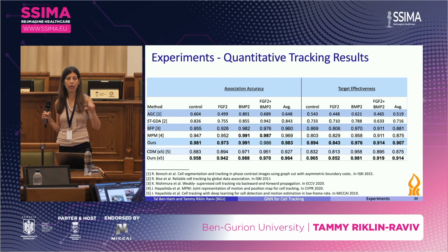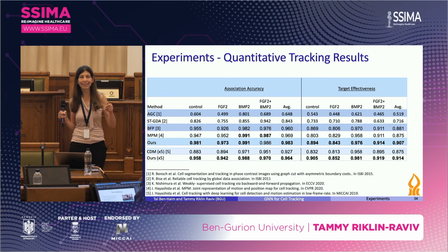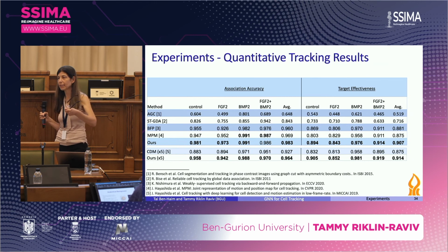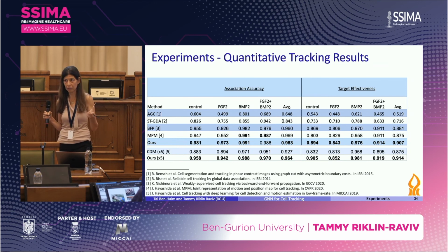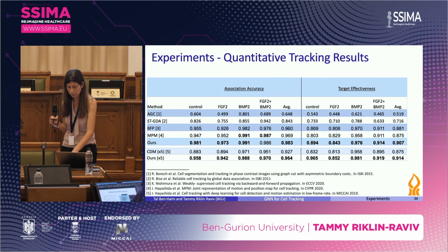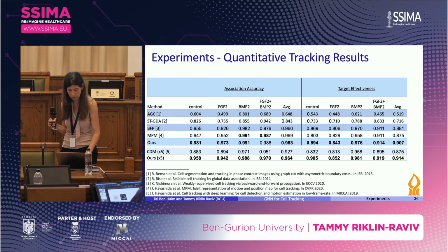Now have a look at the last rows. So we actually change the dynamic by sampling every fifth frame. And even in this case, our algorithm overcome and outperform the other competing algorithm. So this simulates much higher dynamic, 5 times the higher dynamic.